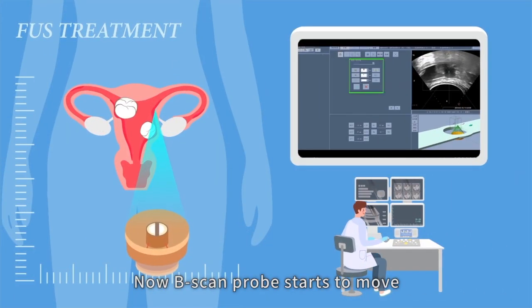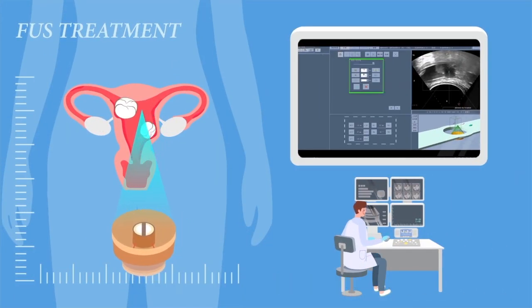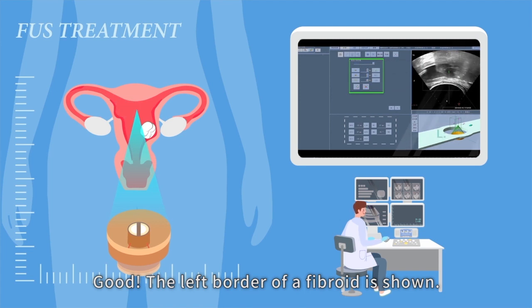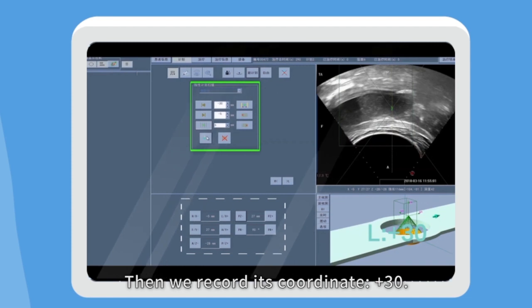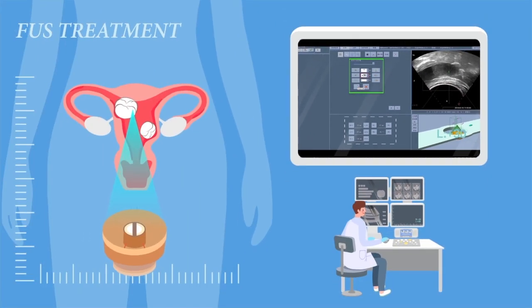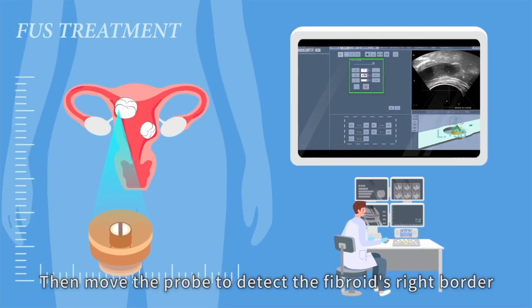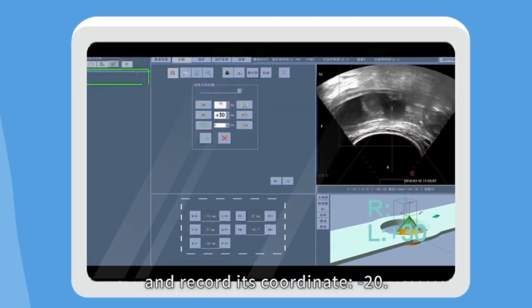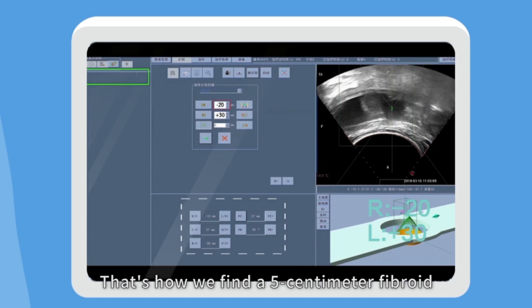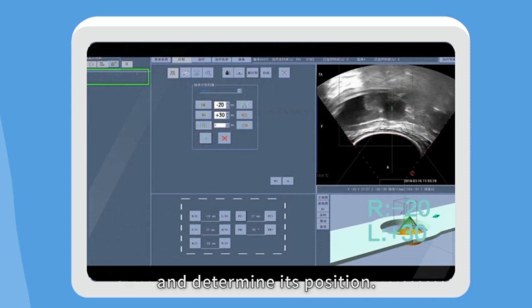The B-scan probe starts to move from the left side of the womb. The left border of the fibroid is shown. We record its coordinate: plus 30. Then we move the probe to detect the fibroid's right border and record its coordinate: minus 20. That's how we find a five centimetre fibroid and determine its position.